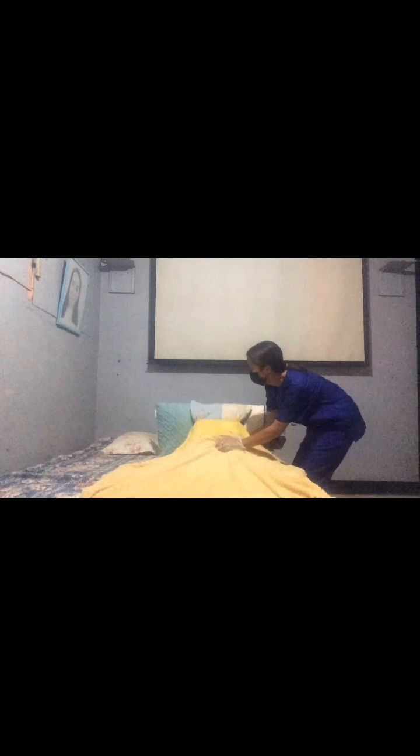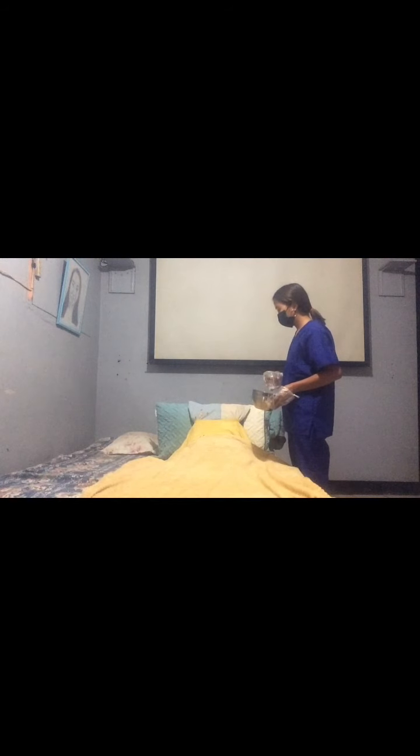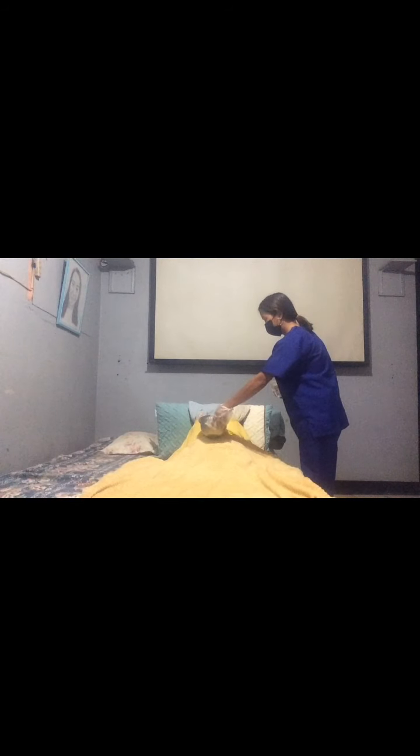Identify the client and explain the procedure. Wear a face mask as a protective device. Provide privacy and assist the client to a sitting position if not contraindicated. Instruct the client to rinse the mouth with plain water and ask to deep breathe before collection of the specimen. Ask the client to cough deeply in order to hack up lung secretion into the sputum container.